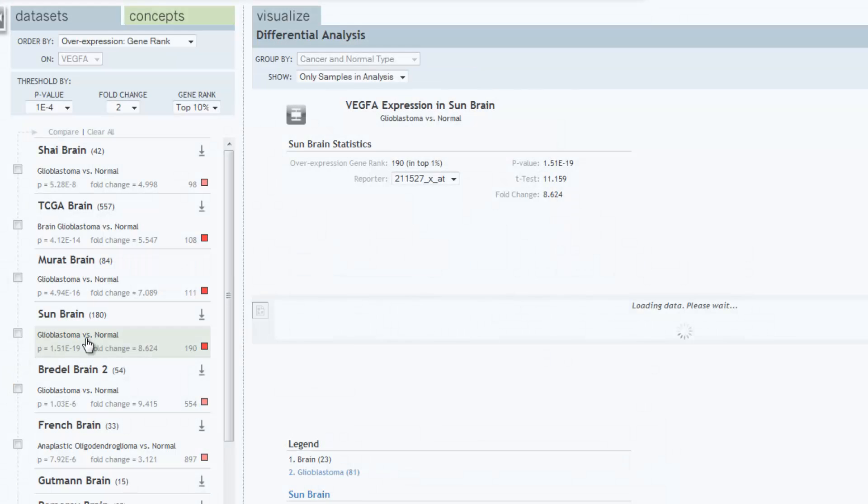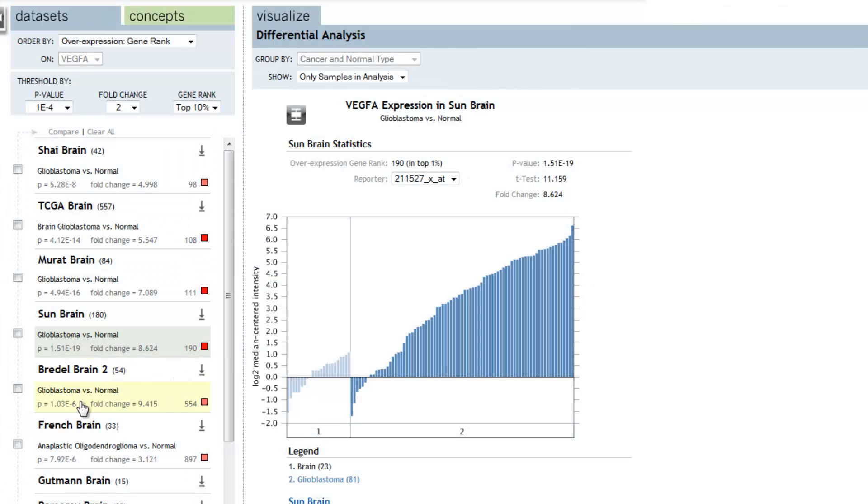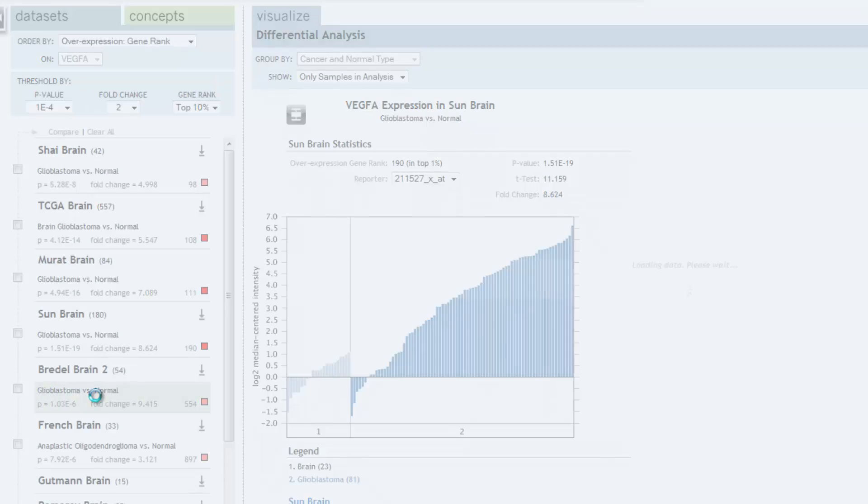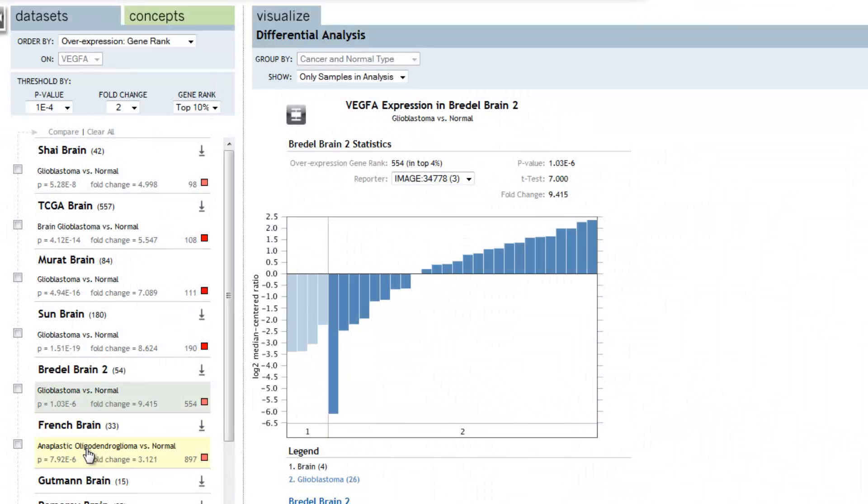As we walk through each of these analyses, we can note independent datasets, independent investigators, the same results for VEGF overexpression in glioblastoma relative to normal tissue. This is an example of looking at differential expression and validating your target across all of the world's experiments.